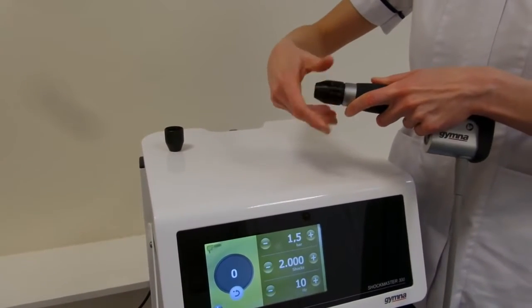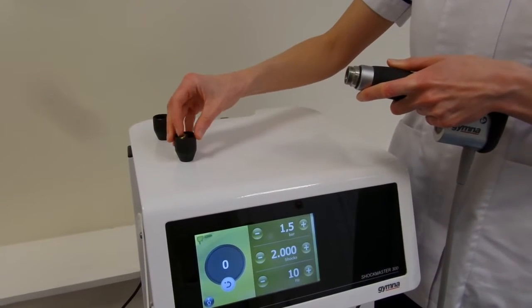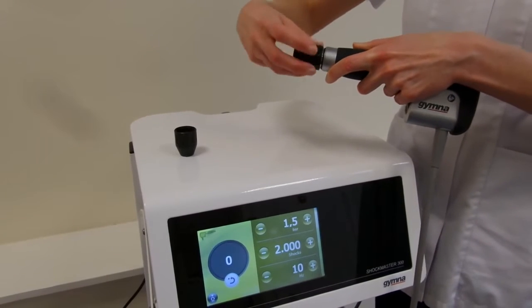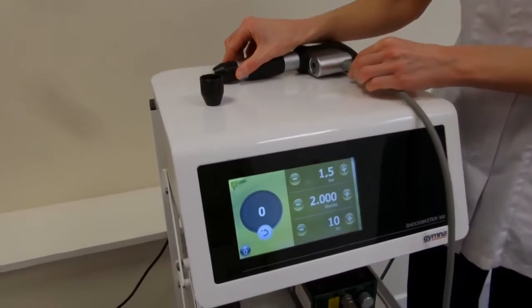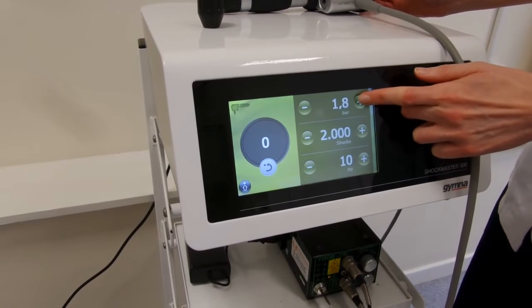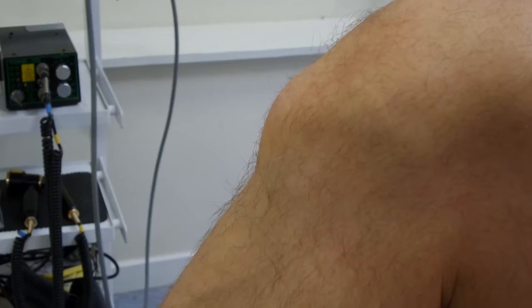To begin this treatment for Osgood Schlatters, the therapist is first going to remove one of the 15mm heads from this Shockmaster 300 from Gymna and apply a 15mm convex head. You can tell this is a convex head as it's silver and not copper in colour. And bring the settings up. So in this case we're going to come up to 2 bar and 12 Hz for 2000 shocks.